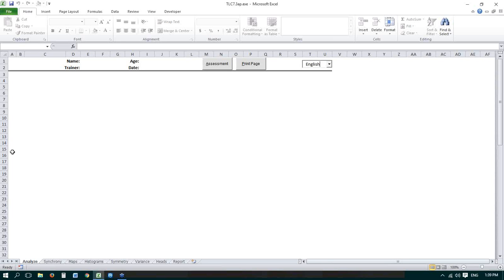Somebody would have to create an output file from that, a text file that we could bring into the TLC, but none of the people who are selling QEEGs have been particularly interested in doing that so far. I've been working for a while with some people to try and find a software possibility that would allow that, but there isn't anything out there that I'm aware of.